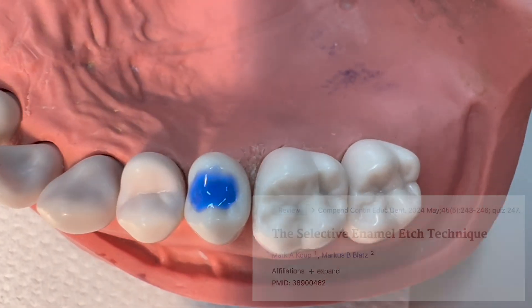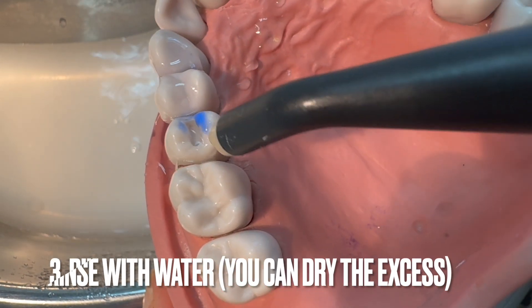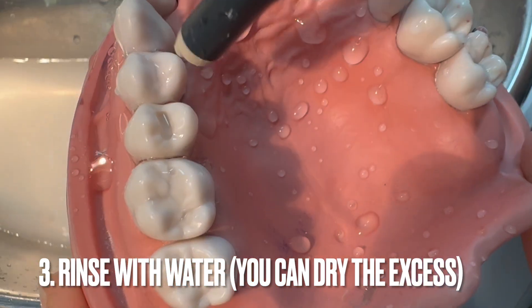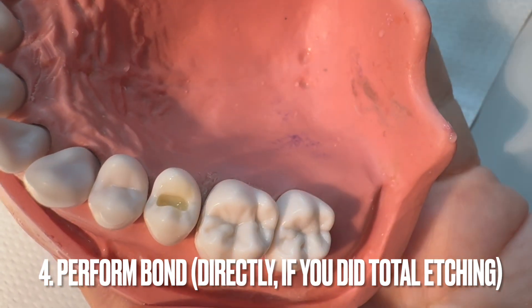There is a recommended reference for you guys — a very nice article from Prof. Blatz and his team. The next step is to rinse with water. The time of etching depends on the materials, and then we are going to do the bonding.